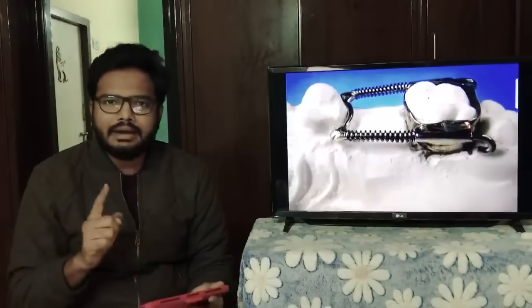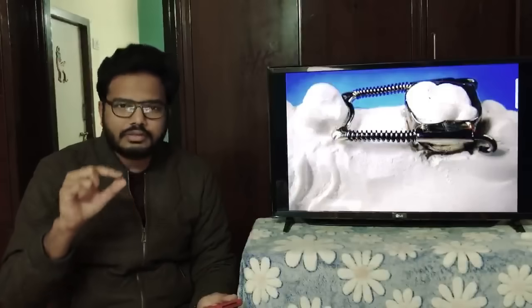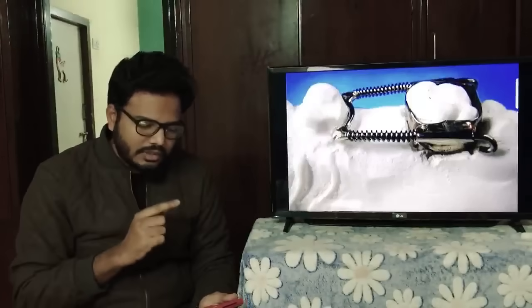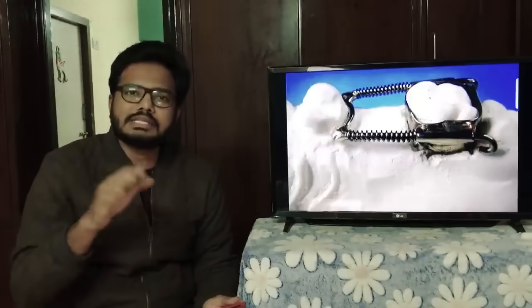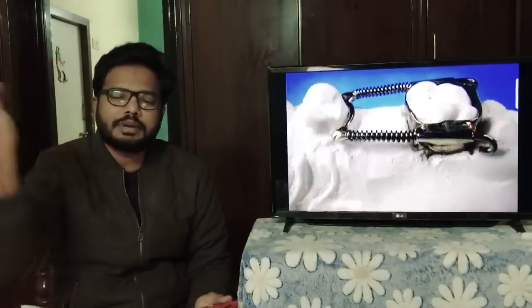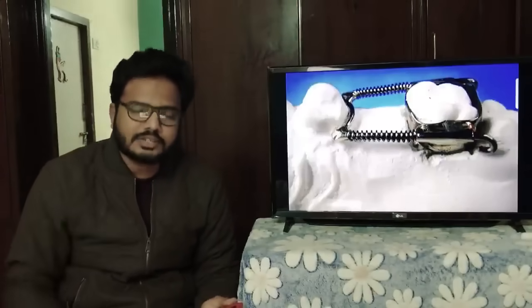You can see a band on a molar. You can see a tube which is soldered to a molar, and then you can see a U-shaped rod. The base of this U-shaped rod is in contact with the tooth which is mesial to the edentulous area. And you can see a compressed coil spring, which generates forces and helps in distalizing this first molar.